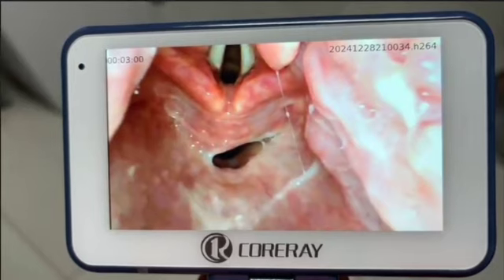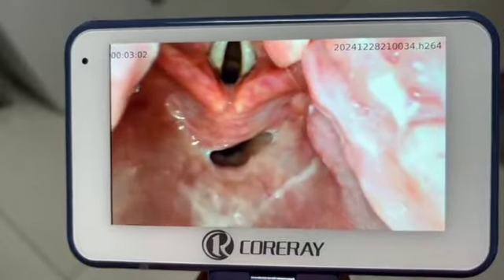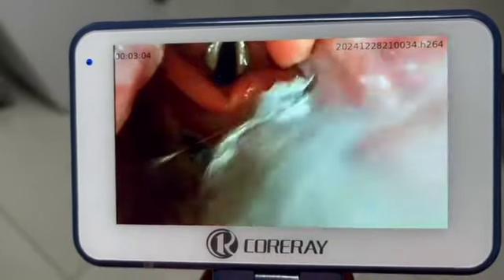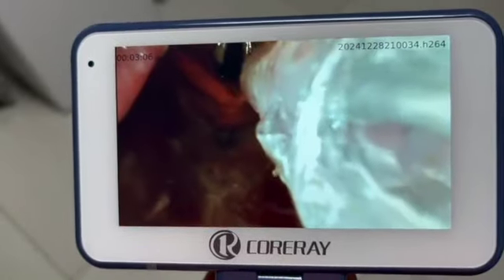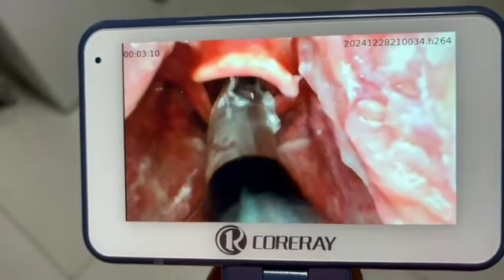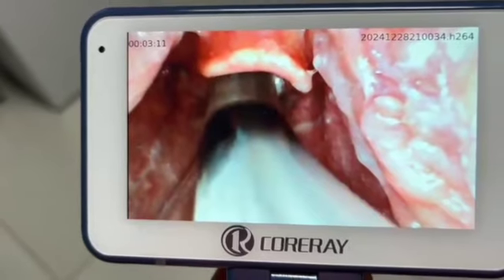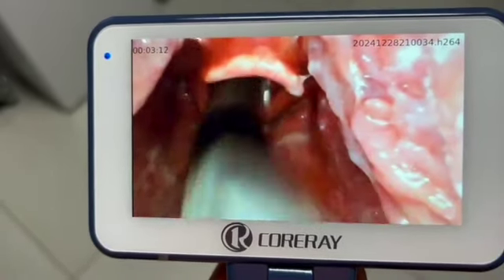perspective. So the very next step that I took was just to pull back with the blade so that we could get a much broader view, and you can see immediately the tube moves quite easily into that patient's airway. And you can see the whole epiglottis, you can see the arytenoid cartilages pulling down to the bottom, and you can see the vocal cords just behind that.